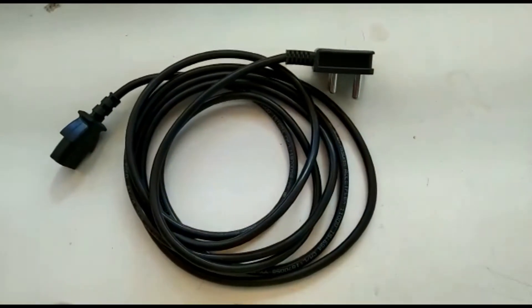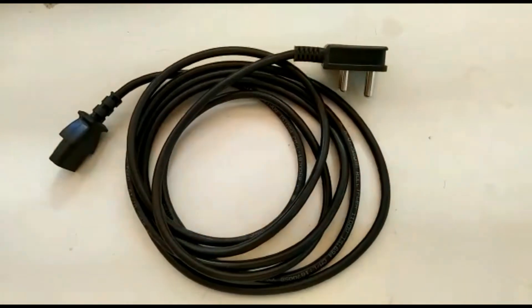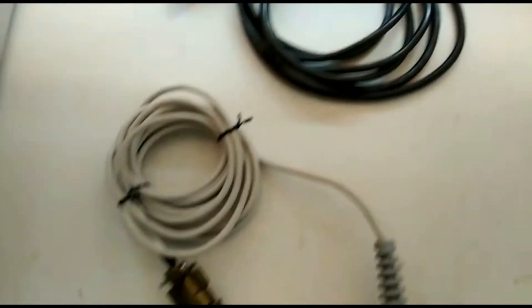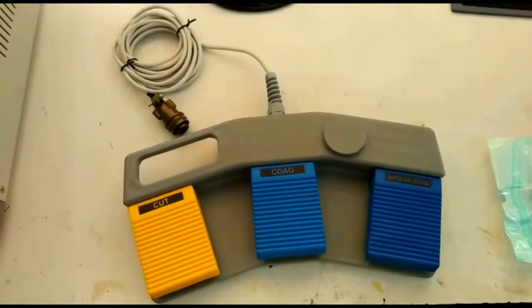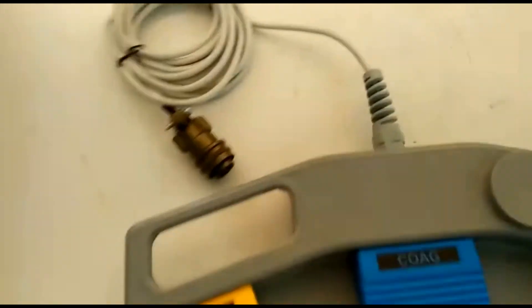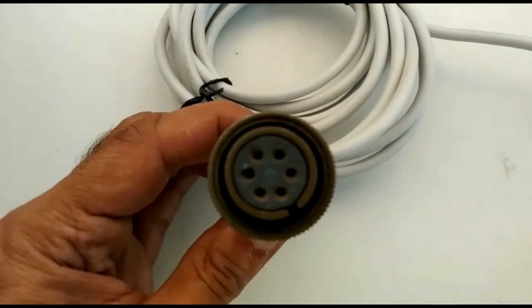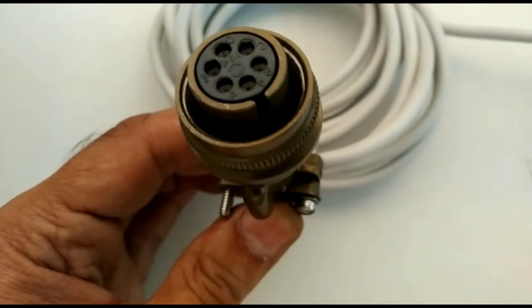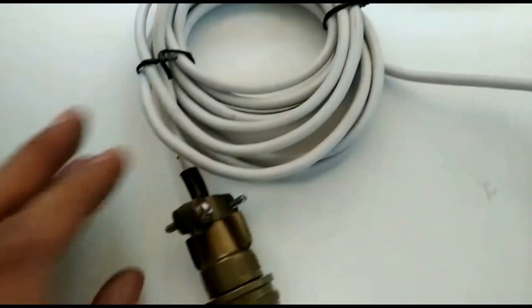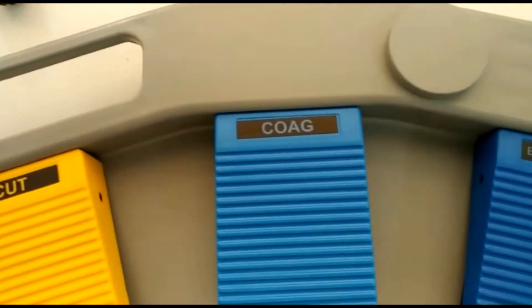Let's look at some of the accessories more closely. This is the power cord — the left side goes into the machine and the right side goes into the power plug. This is the three-pedal foot switch. Please look at the connector closely — you can see a notch on the right bottom side. When fitting it into the machine, observe this notch and fit it properly in the correct orientation.